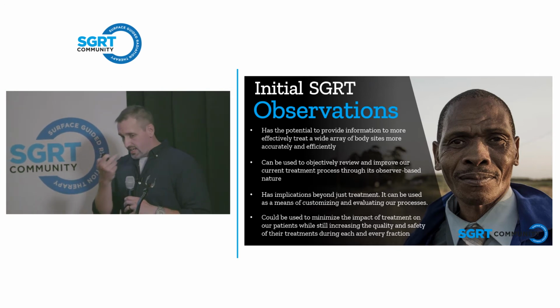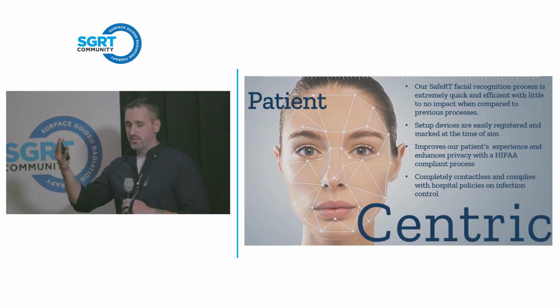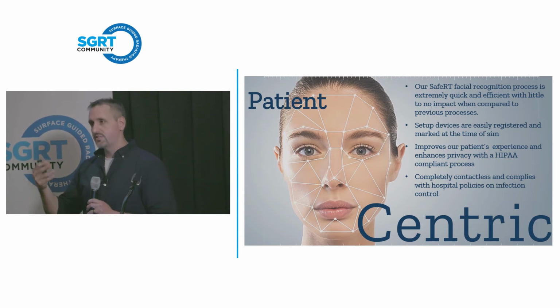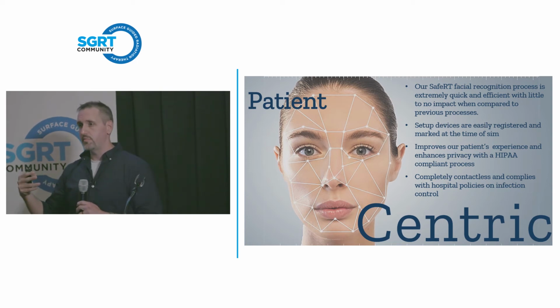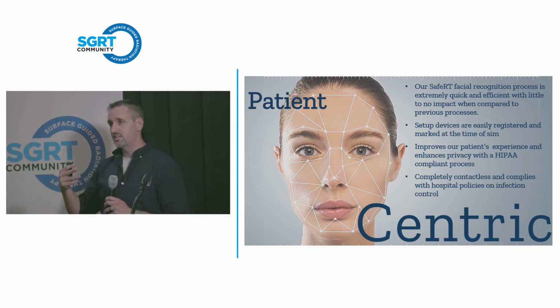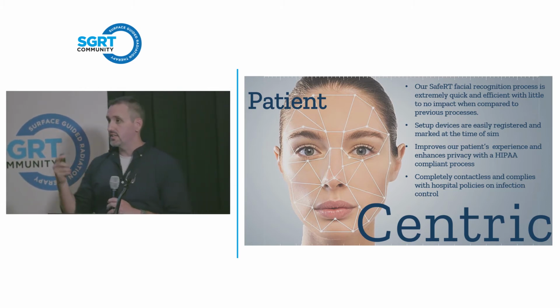One of the things that we tie into SGRT now at our facility is SafeRT. And if you couldn't notice before, we use AlignRT at our facilities after all of our evaluation. But SafeRT now ties into our primary, secondary, and tertiary verification requirements. So we have a primary verification of the patient on the TrueBeam. They are secondarily verified when we open them up in the connectivity through the MMI through AlignRT. So the name, the birth date, the ISO center, and the plan are all verified secondarily on the AlignRT.